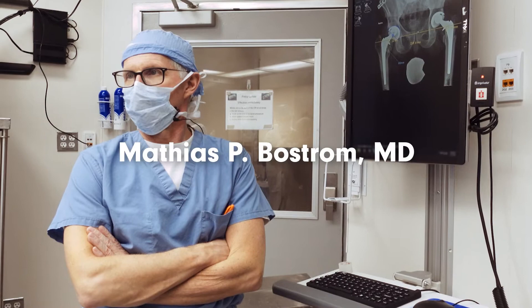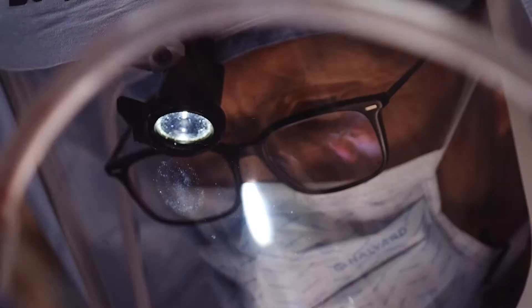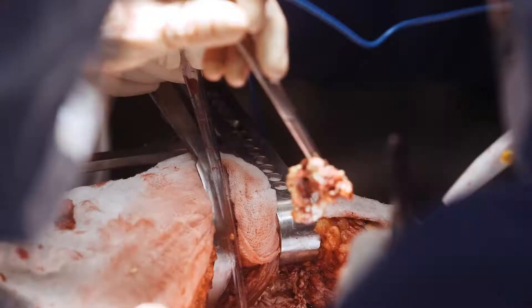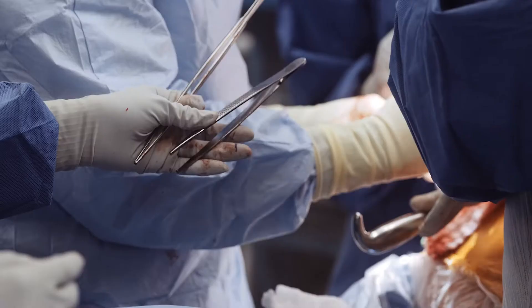Hi, my name is Matthias Bostrom. I'm the chief of the arthroplasty service here at the Hospital for Special Surgery. This patient had bilateral hip replacement several years ago, probably over 10 years ago, and now has significant osteolysis on the left, but less osteolysis on the right.